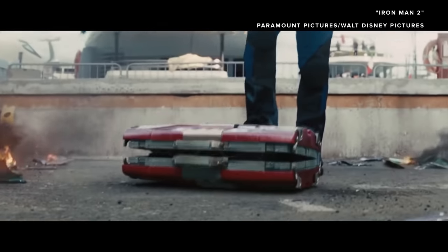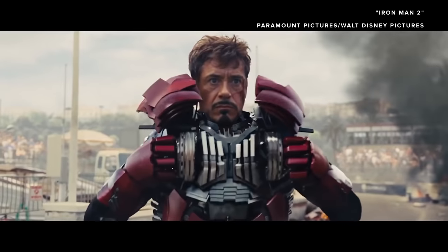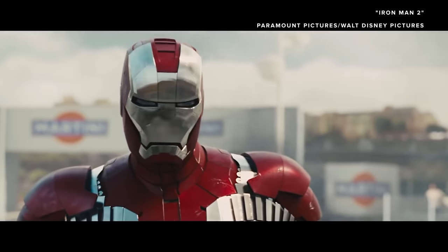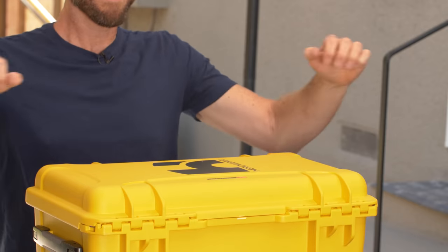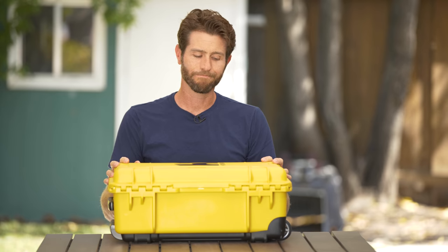Remember that scene from Iron Man 2 when the suitcase turns into Tony Stark's latest suit of Iron Man armor? Watch this. It doesn't actually work that way.